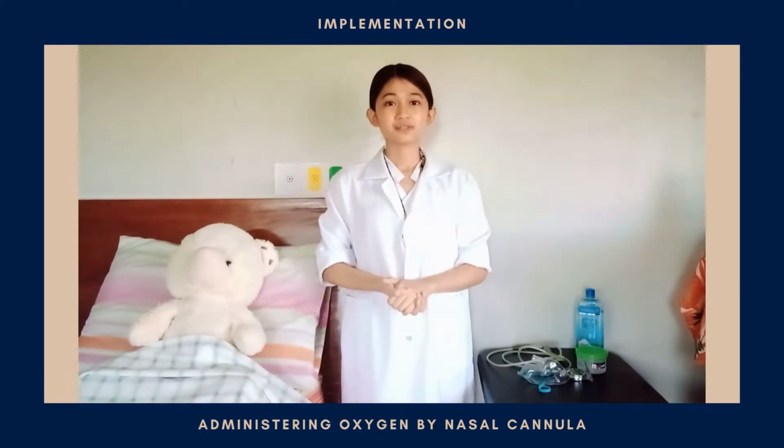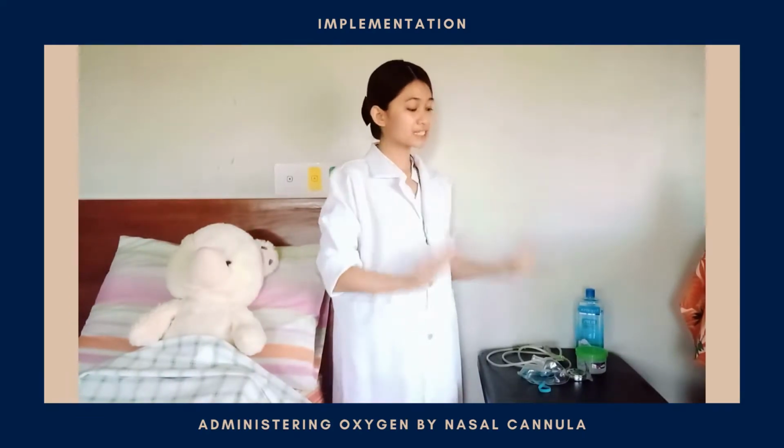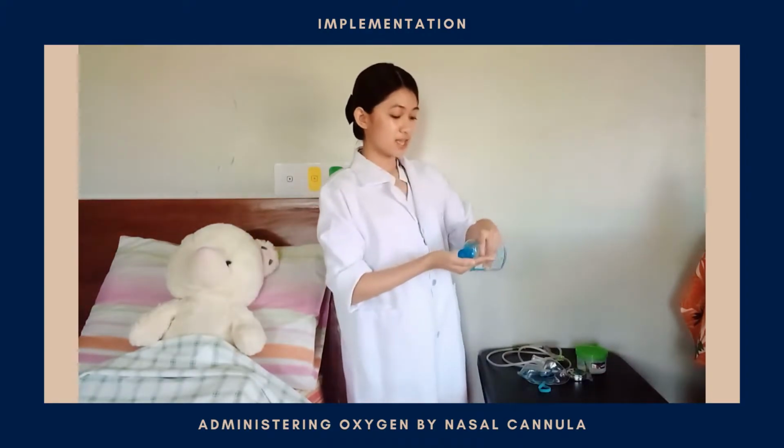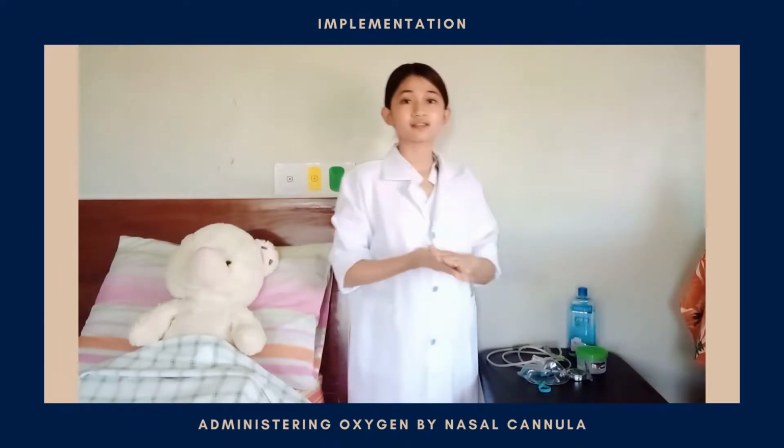For the implementation, bring the necessary equipment to the bedside stand or the overbed table. Then, perform hand hygiene and put on your personal protective equipment if indicated.